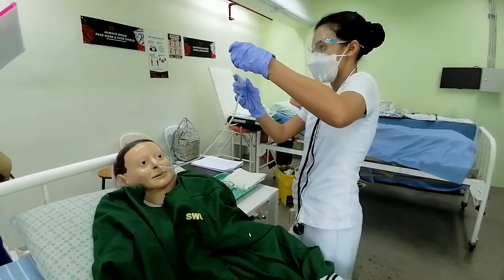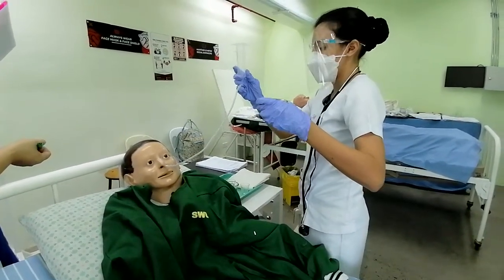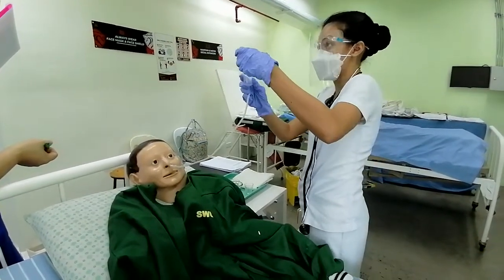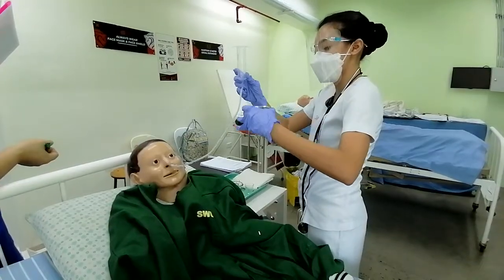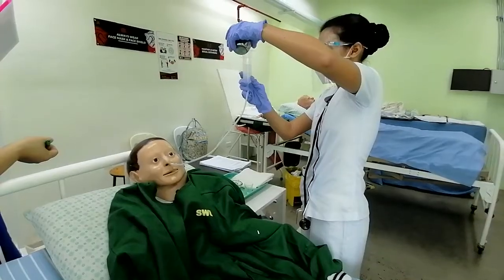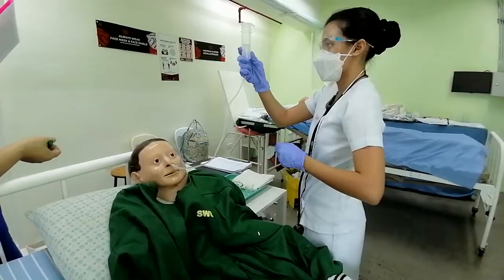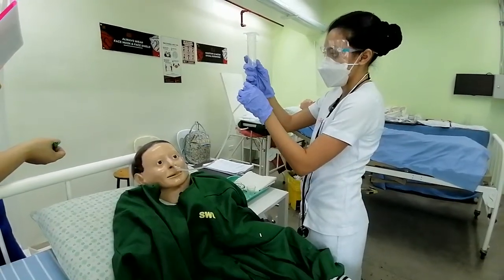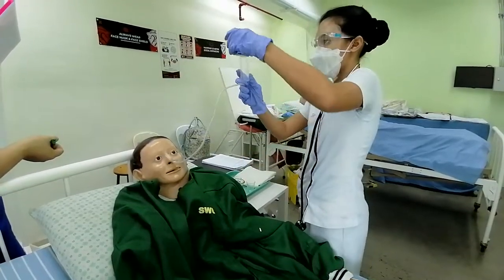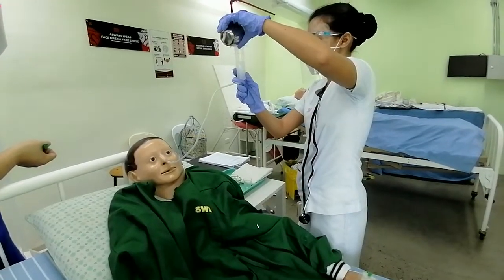What is the rationale of what you're doing? The purpose of irrigation is that it cleanses the tube. Also, it can determine the patency, and then you will start the feeding. Then I hold this. And then the purpose of this, sir, is to prevent air embolism as well.